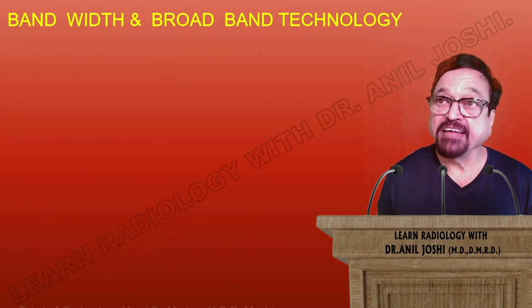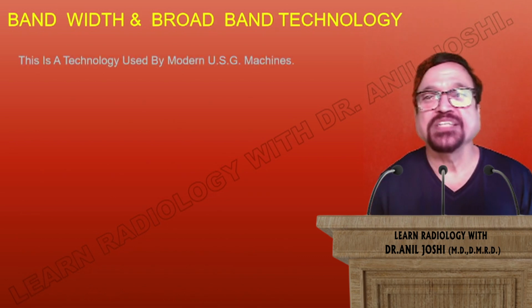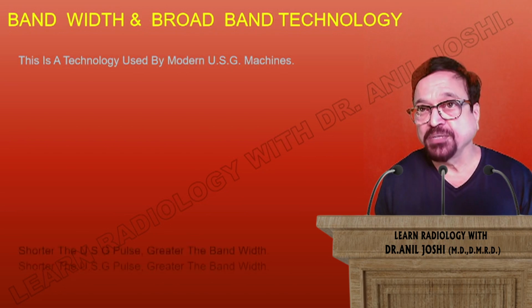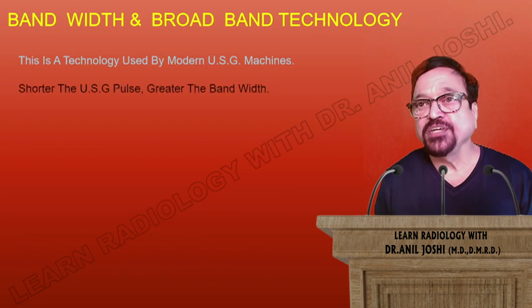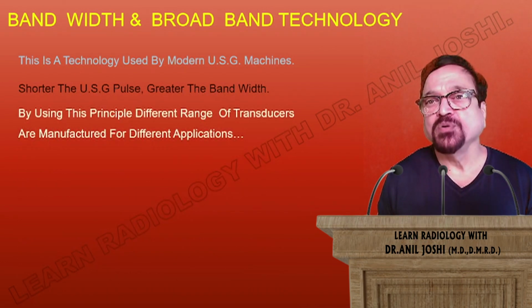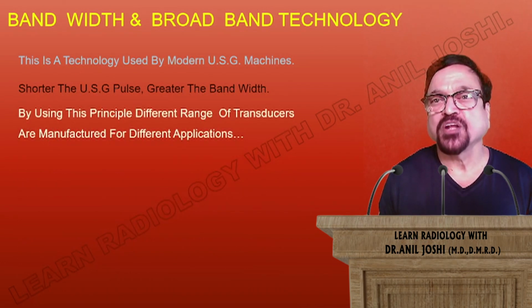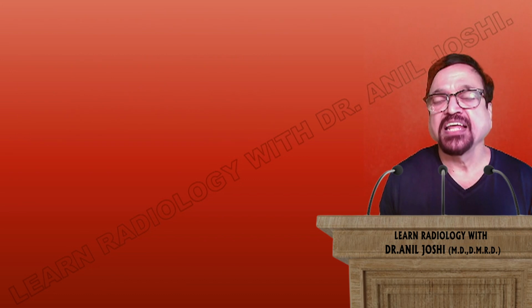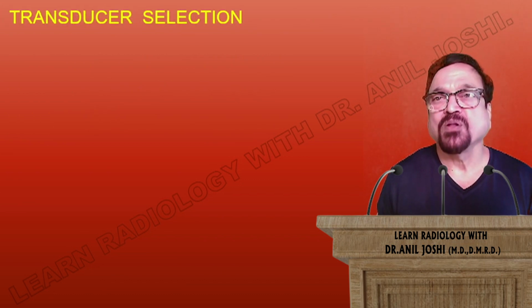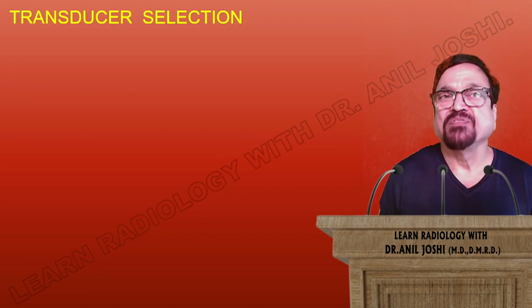Now, what is bandwidth and broadband technology? This is a technology used by modern USG machines. The shorter the USG pulse, the greater the bandwidth. By using this principle, different ranges of transducers can be manufactured and applied to different pathologies, different organs, and different areas.